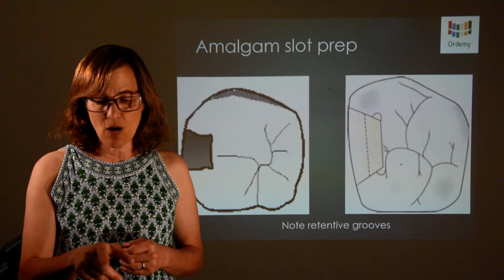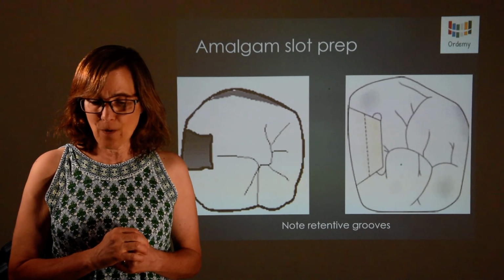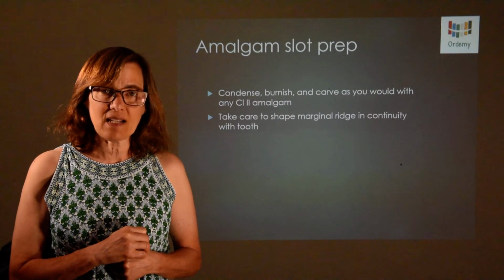Again, you will see on the buccal and lingual the retention grooves in there. So we need to condense in a step-like fashion.